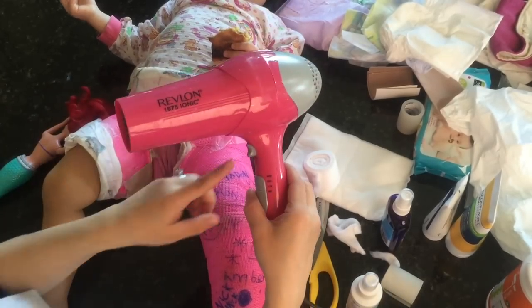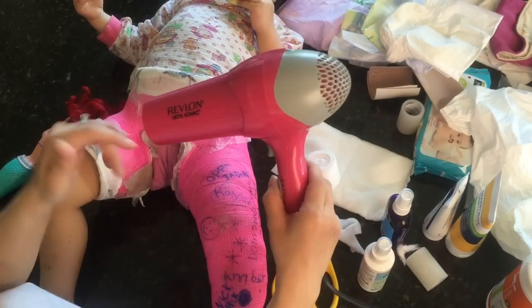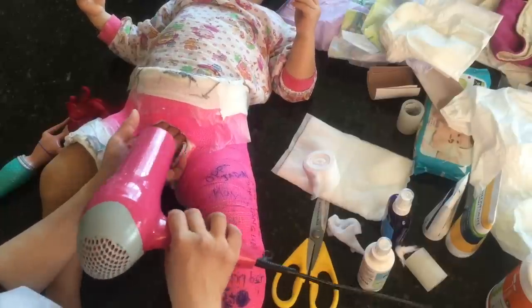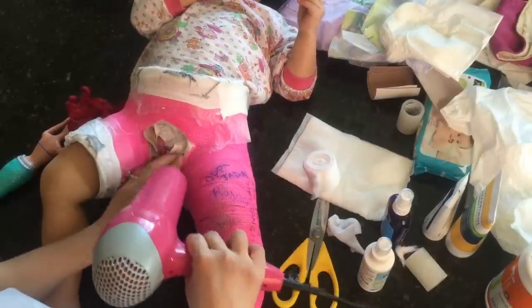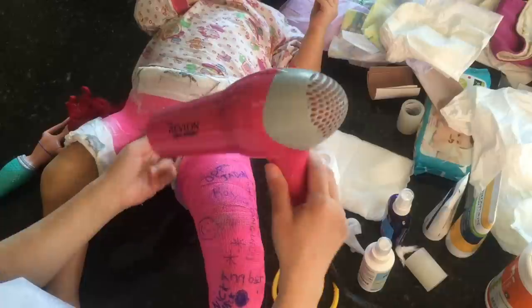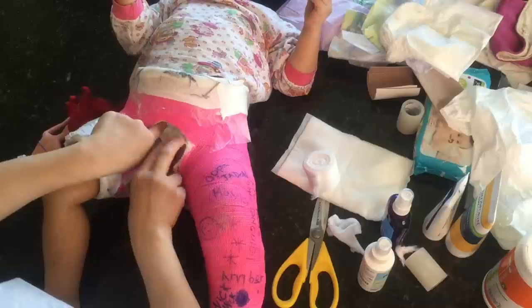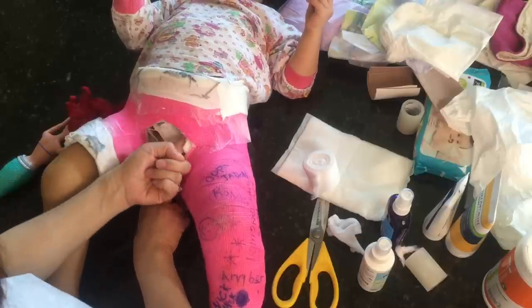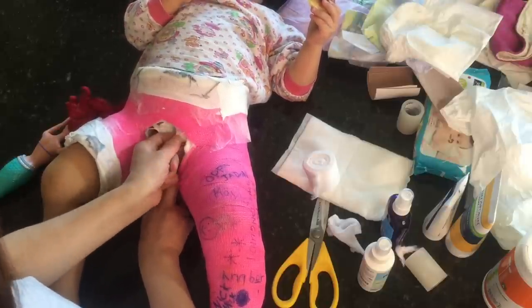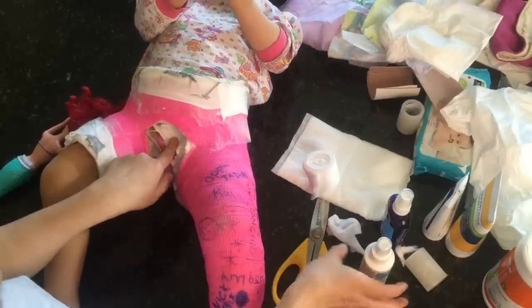Then you get a blow dryer — this is a step you really need to do. Use the cool setting, going back and forth, putting your hand in there to check. I dried her for about 15 to 20 minutes until when I put my finger in it was pretty much all dry. The yellow gooey sponge was still a little stinky but the spray helps prevent more odor.